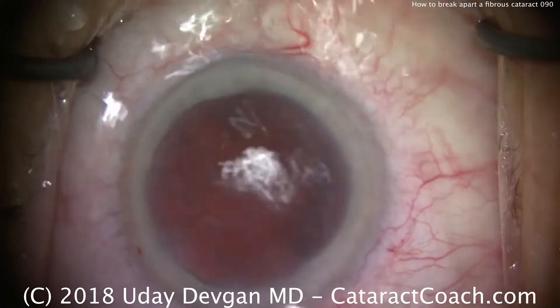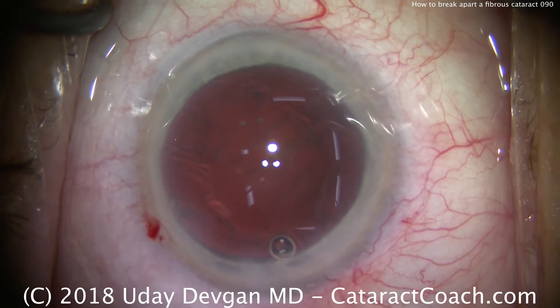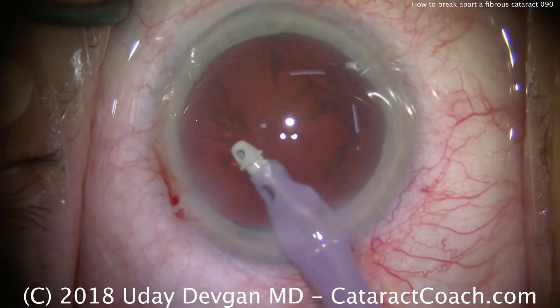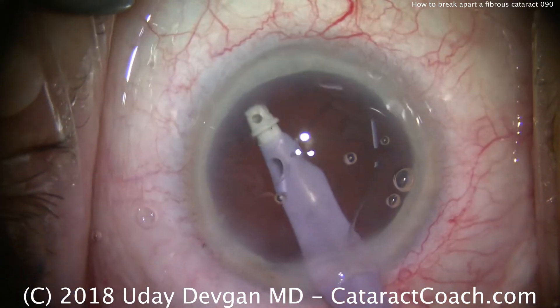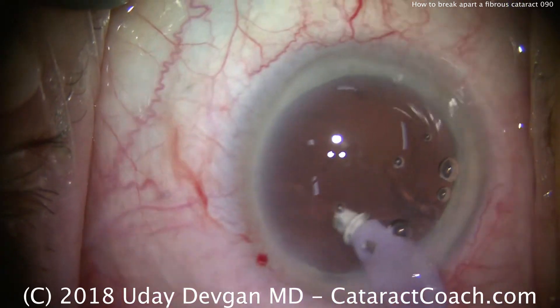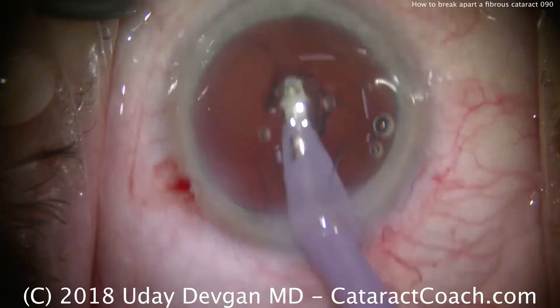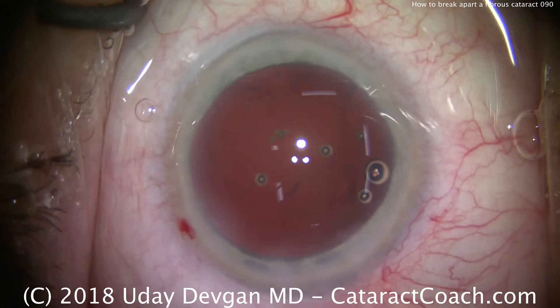Now we're ready for our irrigation aspiration — here's the IA probe. That went great. Again, with a fibrous nucleus, if you don't get the chop propagating fully through the nucleus, if you're unable to split it into halves or quarters, that's okay. Just keep rotating and chop a little bit. Even though you're just scoring the nucleus or only partially separating it, once you've rotated enough and done a half dozen or more chops, you'll start to get pieces breaking off, and then it disassembles relatively easily.